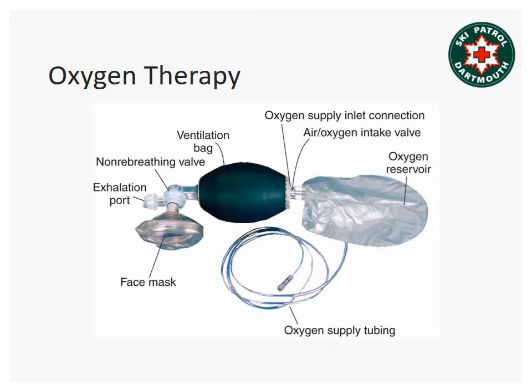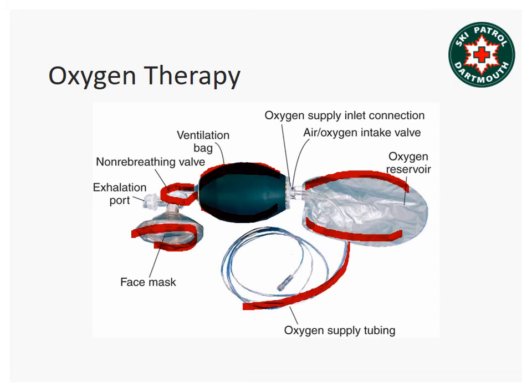And these will deliver an inspired oxygen percentage of 80 to 100%. The reason this is called a bag valve mask is because it has the self-inflating bag, which you hold onto and squeeze, the valve, which means that air or oxygen flows into the patient and not back into the bag, and a face mask. It also should have an oxygen reservoir, which inflates similar to that on the non-rebreather mask, and a supply tubing that's connected to our oxygen regulator.